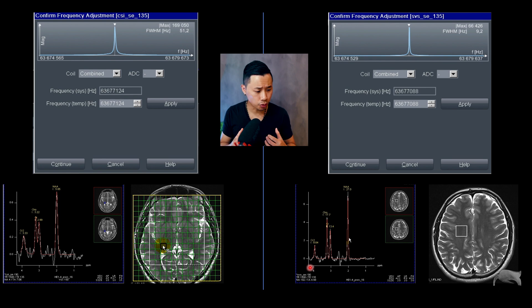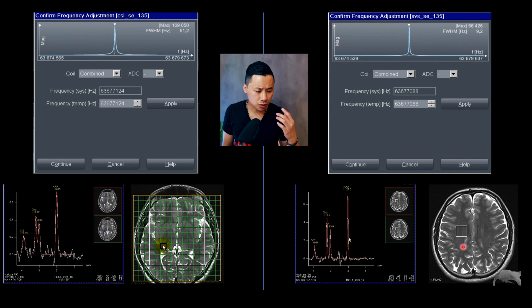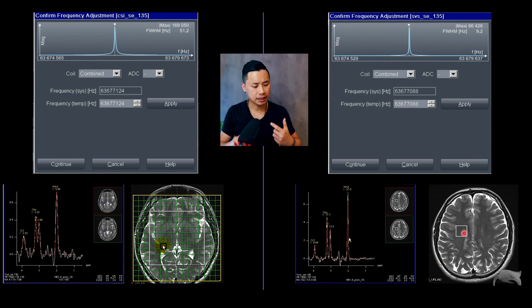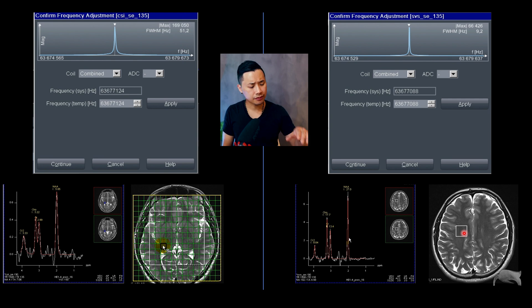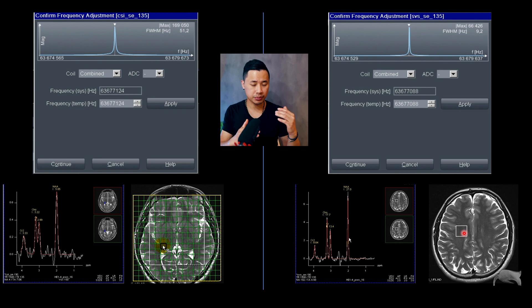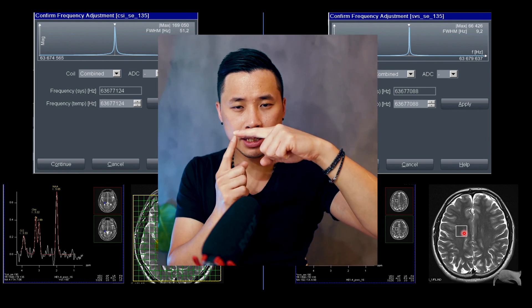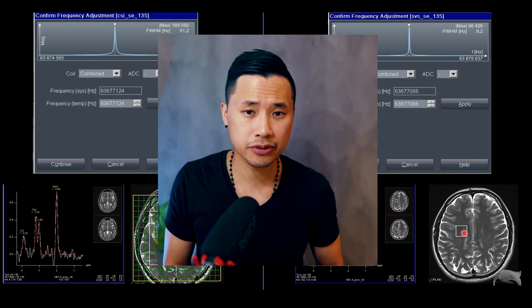One more important thing: if you have a small tumor and a large single voxel, be very careful. If the tumor is just a small area inside the voxel, you'll have interference between tumor tissue and normal brain tissue in the same voxel. Make the voxel as small as possible. Also, when doing spectroscopy, always look at it in different planes — axial, coronal, and sagittal — because the voxel is three-dimensional. Do not rely on only one plane, because a voxel that looks small in one plane can be much bigger when viewed from another angle.